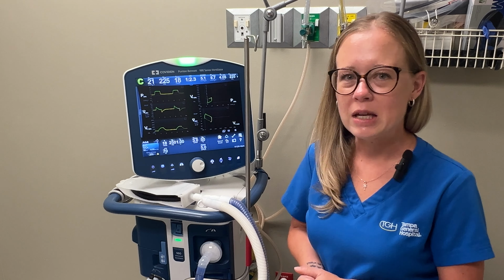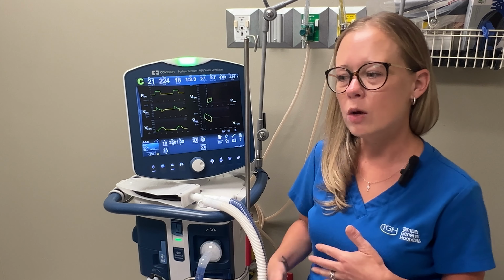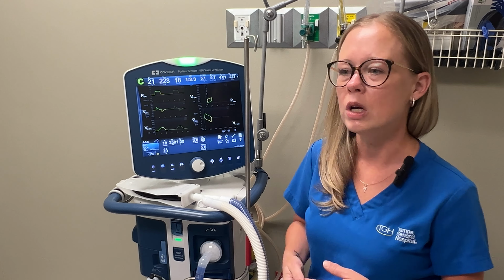Everything here on the bottom of the screen that you see, these are all of our settings. That's what we want for the patient to correct their arterial blood gas or according to their disease process. That's what we want from them. However, they may be doing something different. Up here shows what they are doing.